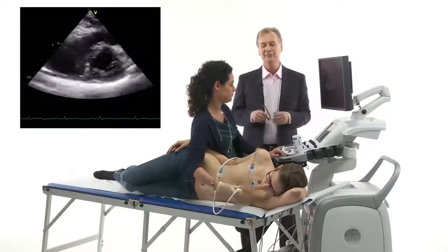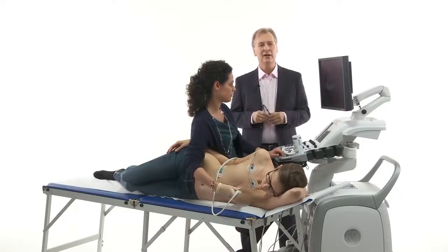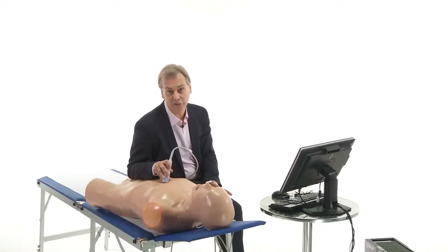I actually prefer the short axis view if you really want to get a quick impression of how ventricular function is. Of course there are many more views, but we'll show you these later. So congratulations — your first view. But to give the short axis view a little bit more depth, we want to provide you with a short simulation so that you better understand the anatomy and the cut plane. Here are a few very important tricks that will help you to optimize the image so that you get a very good short axis view.